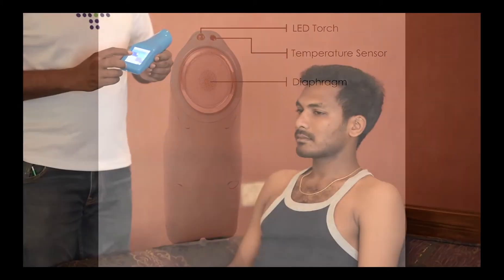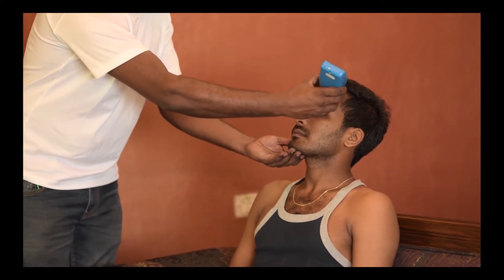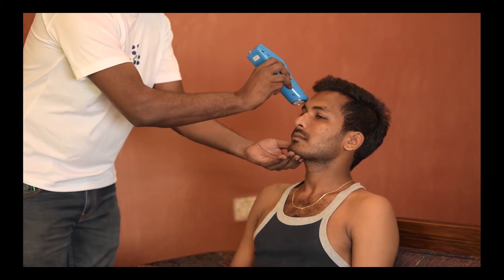We will now look at temperature measurement. We can see the temperature sensor as shown on the diagram. We activate the temperature measurement through the touch screen. Scan the temple and forehead to measure the temperature as shown in the video.